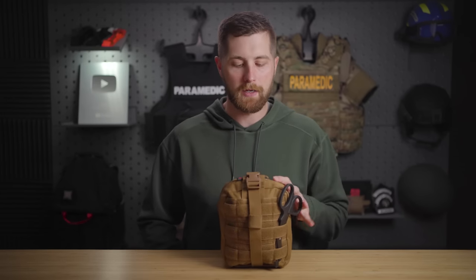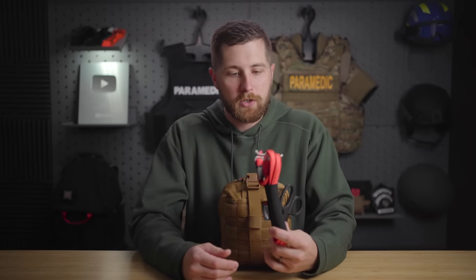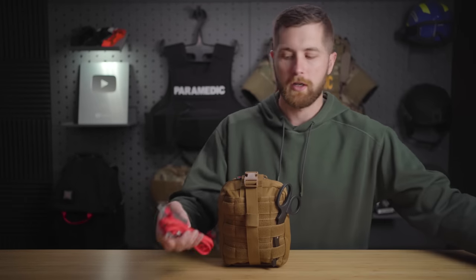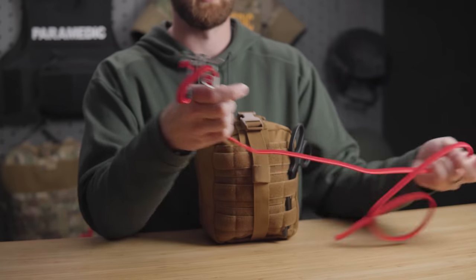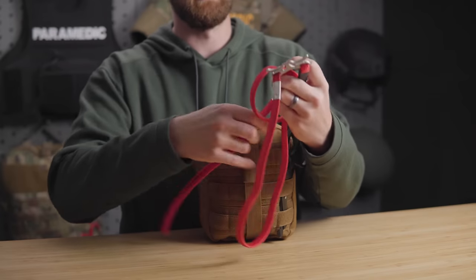One thing about MyMedic — they recently bought RATS. The RATS tourniquet: those of you that have been watching this channel know my feelings on it. I don't like this for a couple of reasons, and this always stirs up controversy. I don't recommend it; it is not a COTCCC-recommended tourniquet and it has some major flaws. When looking at a tourniquet, we want ease of application. This is relatively difficult to apply for a single person. You start looping it around the leg, make about three loops, and secure it — it's just difficult to do, especially if your hands are bloody or you're stressed.